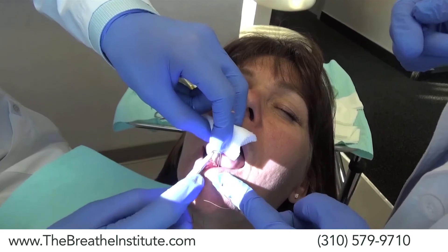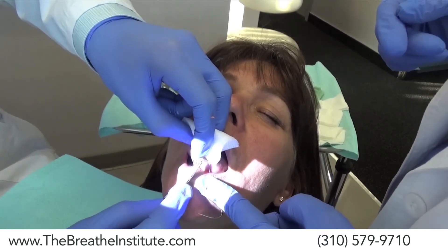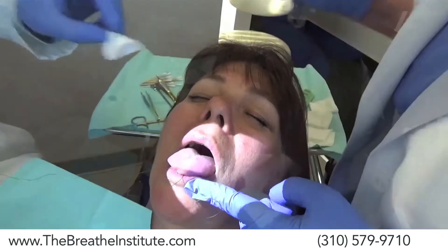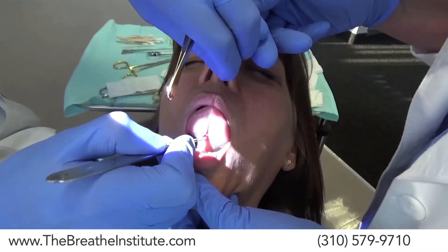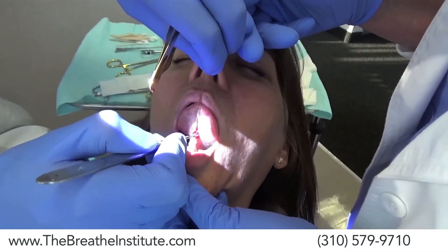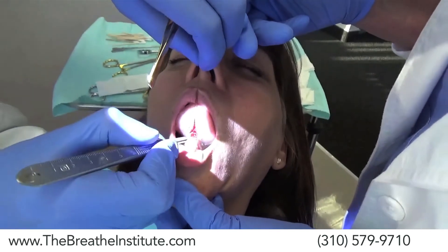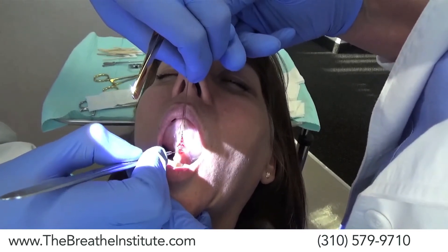Dr. Zaghi is going to use a retraction stitch to help pull the tongue — this isn't what we normally do. He is making small, precise cuts to make sure that he is only cutting as much as he needs to while still cutting everything he needs to.